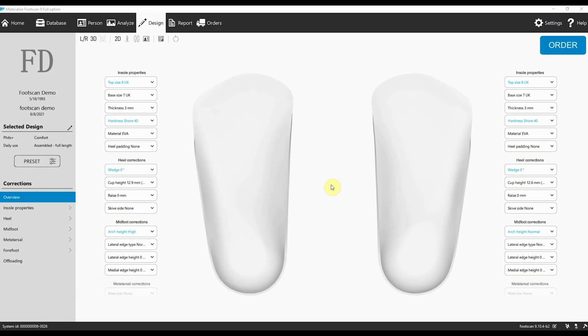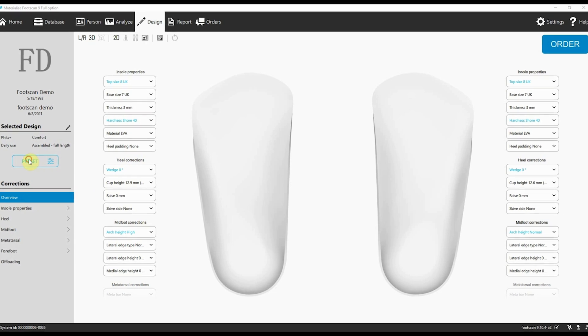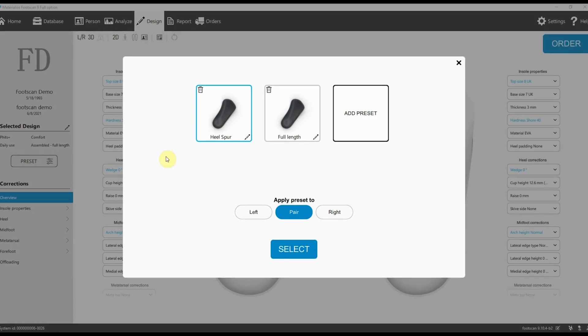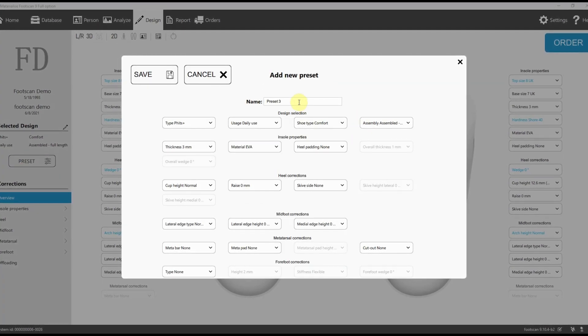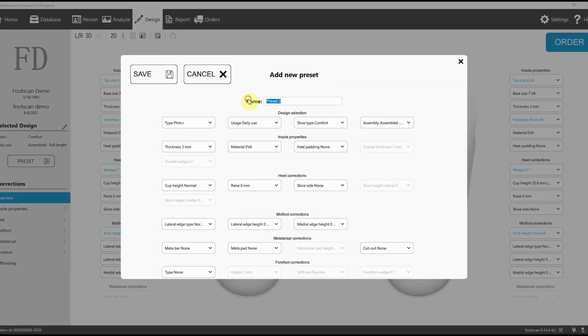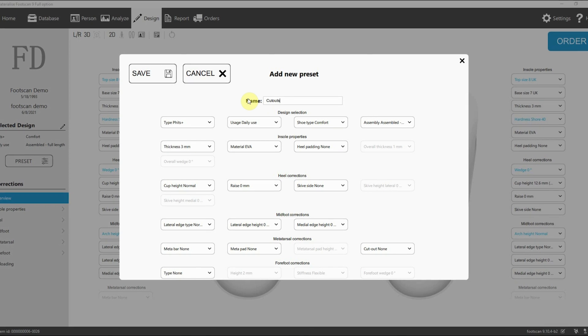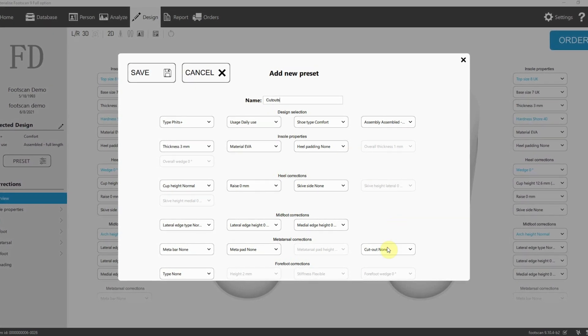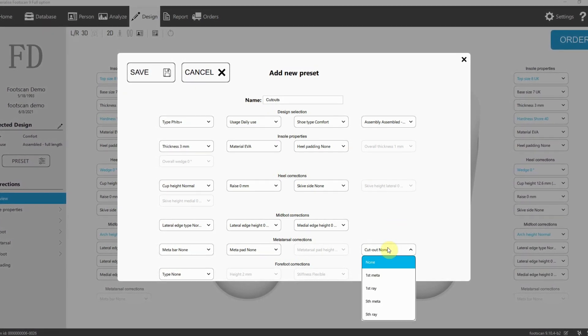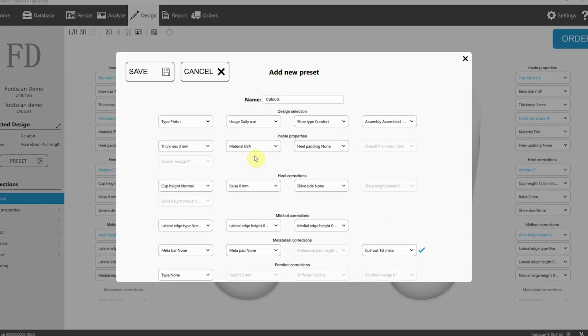We understand that healthcare professionals need to work quickly and efficiently. That's why we've introduced customized presets. With just one click, you can select designs tailored to specific patients or pathologies, saving you valuable time.